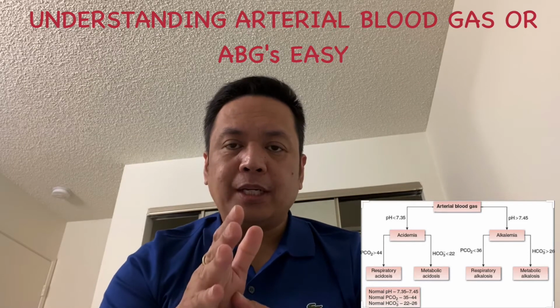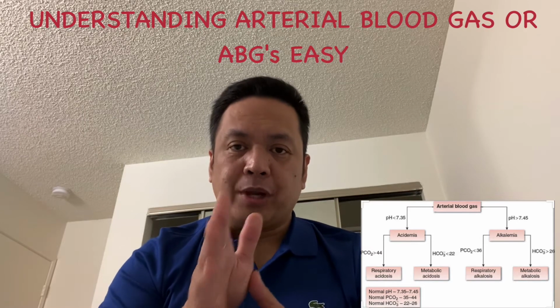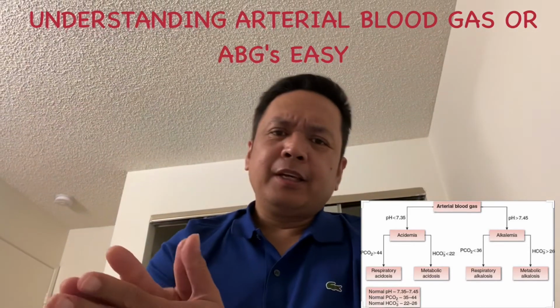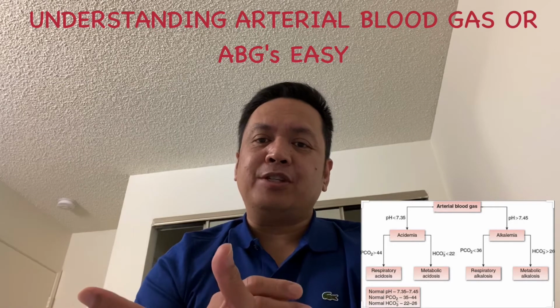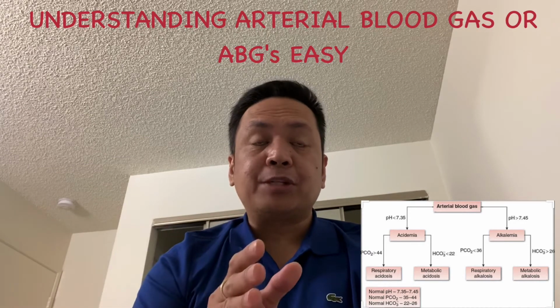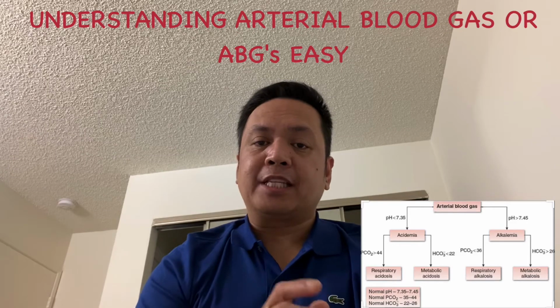So the normal is considered to be from 22 to 26 millimoles per liter. Let's put it simply. When the numbers in the ABG result fall outside of these ranges, you can then determine what type of problem the patient is experiencing.